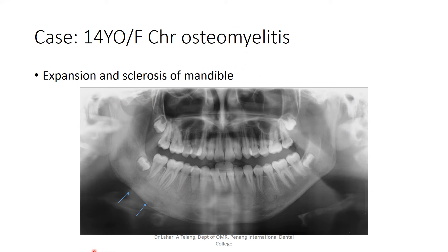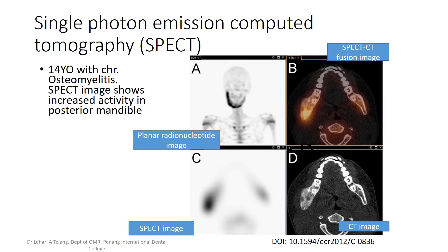Here is a case of a 14-year-old female patient with chronic osteomyelitis. On the panoramic radiograph, we can see expansion and sclerosis of the mandible on one side — compared to the other side, which appears normal. The osteomyelitic region is not very obvious on the panoramic radiograph, which is why this patient was subjected to SPECT (single photon emission computed tomography). SPECT shows increased activity in the posterior mandible. When the CT scan and SPECT images were fused, the exact location of the disease was clearly identified.